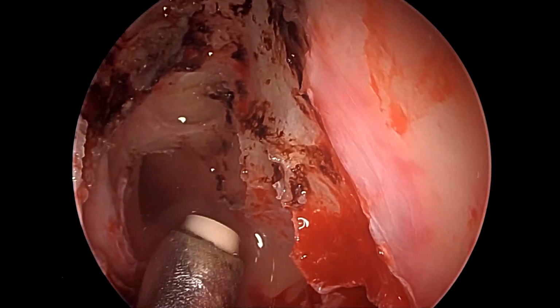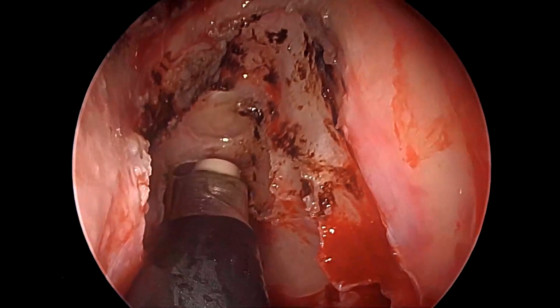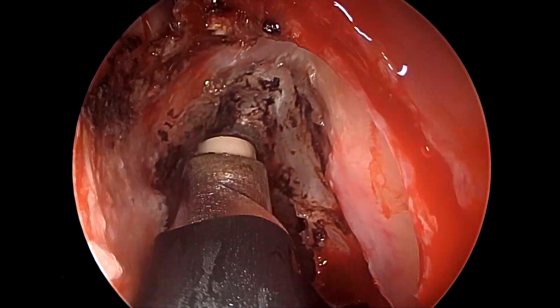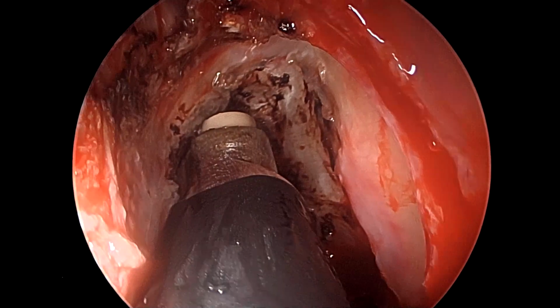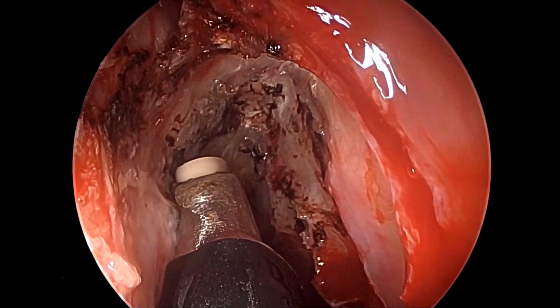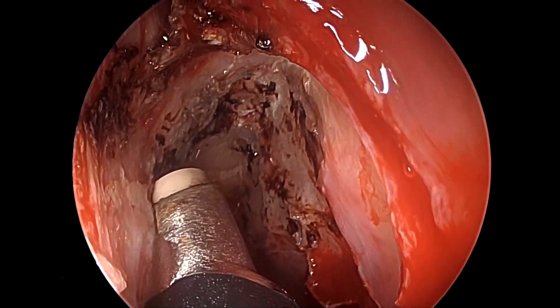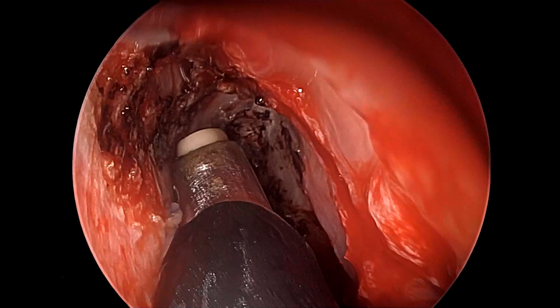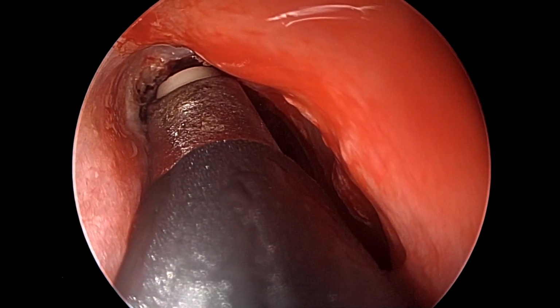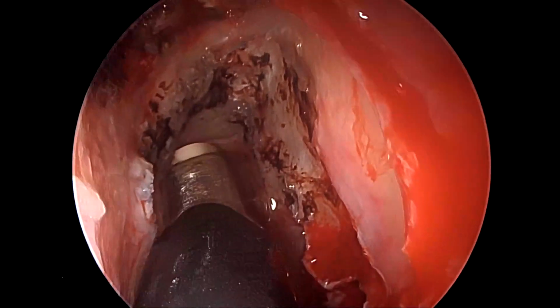So now we can see how the lamina papyracea is practically bared, at least in its superior half, around the defect site, as well as the corresponding surface of the middle turbinate mucosa. And now we are just using more and more coagulation on the skull base defect and the exposed area proper, so that any contact here would not lead to unnecessary bleeding and contamination of our surgical field.